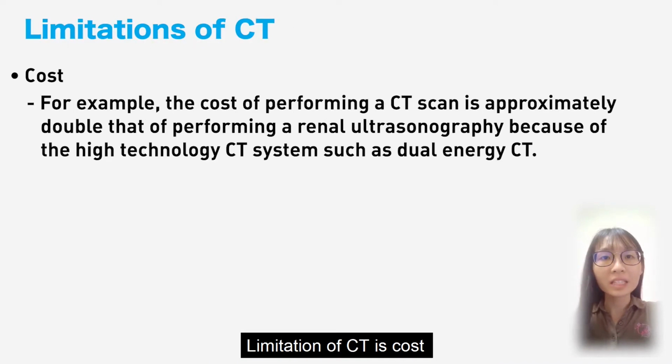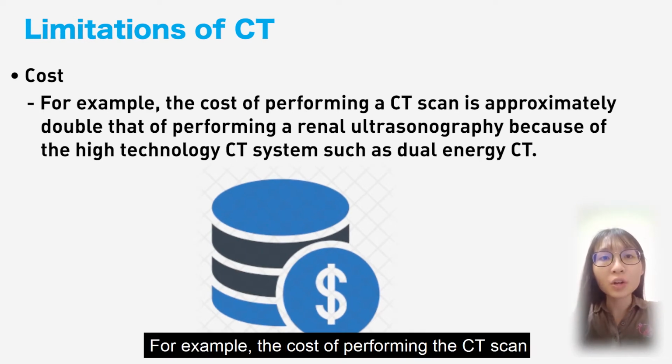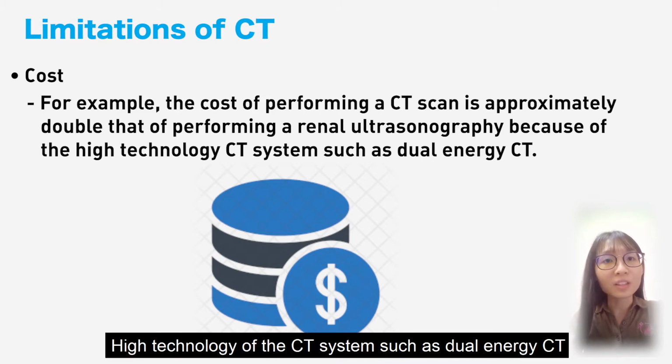A limitation of CT is cost. For example, the cost of performing a CT scan is approximately double that of performing a renal ultrasonography, because of the high technology of the CT system, such as dual energy CT.